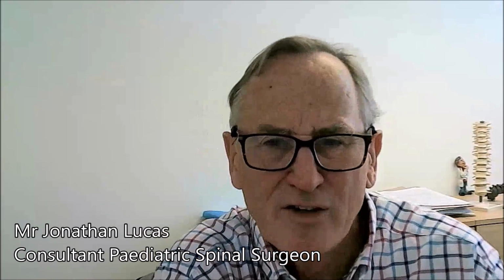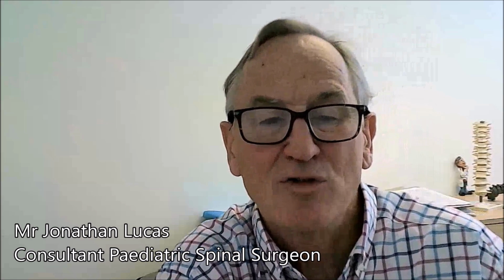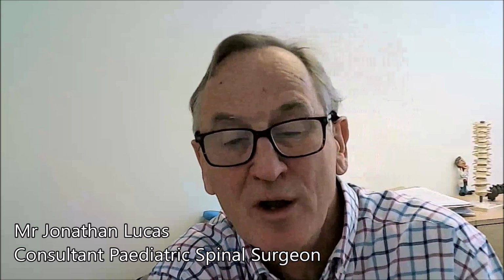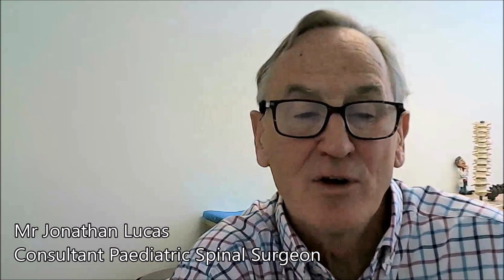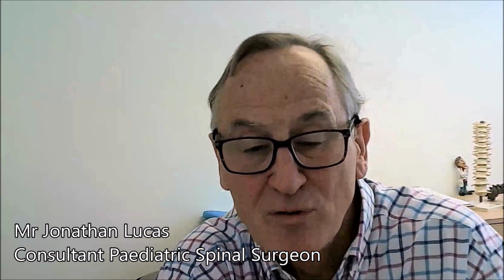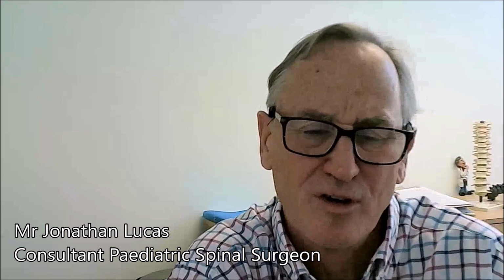Recovery following navigated surgery is in fact exactly the same, because the operation you're doing is exactly the same. It's just allowing you to do it in some cases in a better way, whereas before the surgery was much more complicated and difficult to achieve. So it's giving you a tool to achieve complex surgery more reliably and better, but the actual operation you're doing is exactly the same. So the recovery following the surgery is exactly the same as compared with traditional surgery.